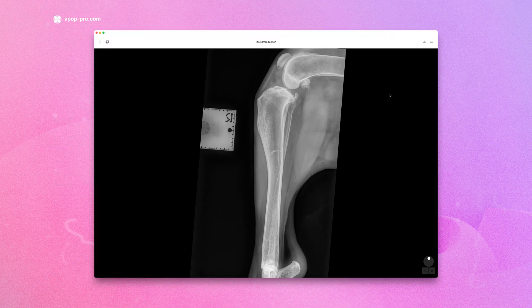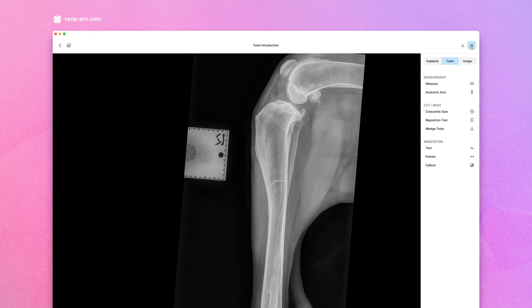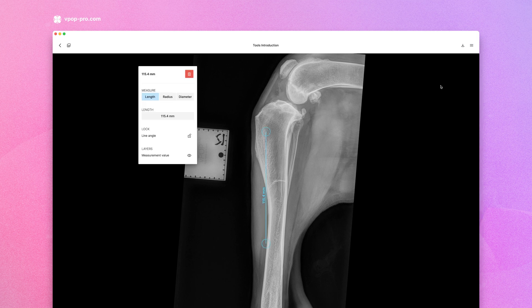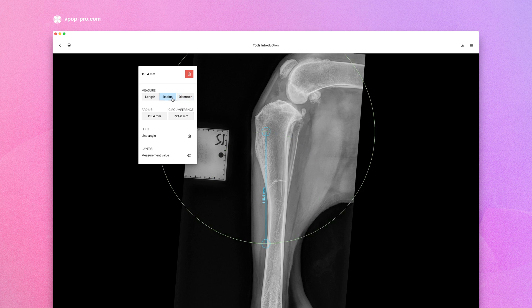Measuring lines, circles, and angles: navigate to the right-hand menu in the case view and select the Tools tab, then select Measure. vPop allows you to measure diameter, circumference, radius, and length.